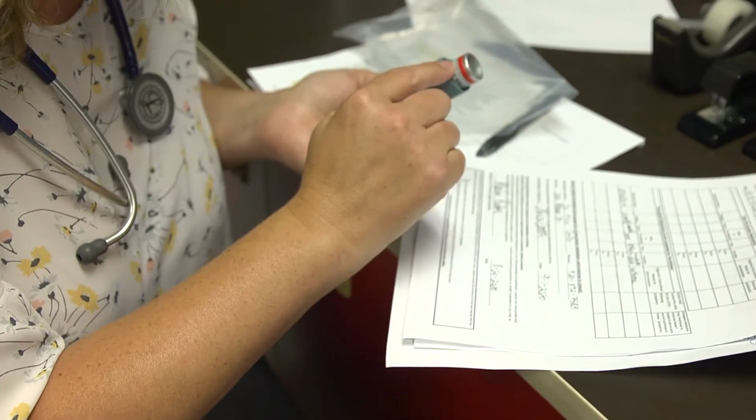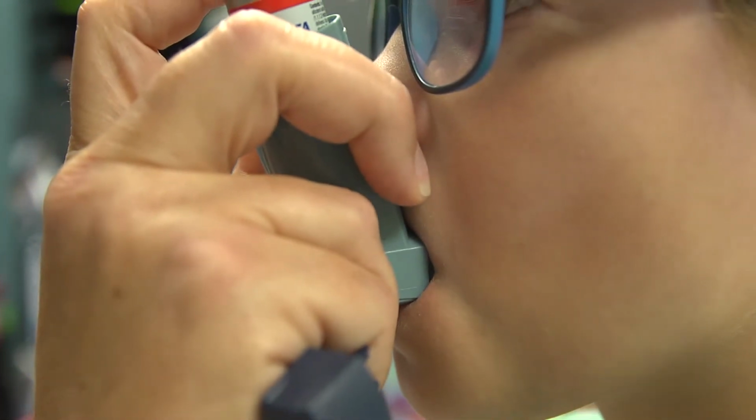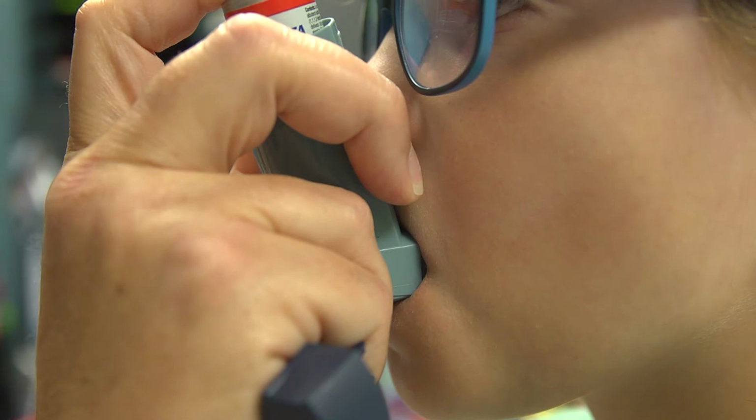Procedure for inhaler without spacer. Hold the inhaler between your index finger and thumb. Have the student stand up and take a deep breath in and breathe out. Have the student put the inhaler in their mouth, between their teeth and above their tongue. Have the student close their lips around the inhaler.